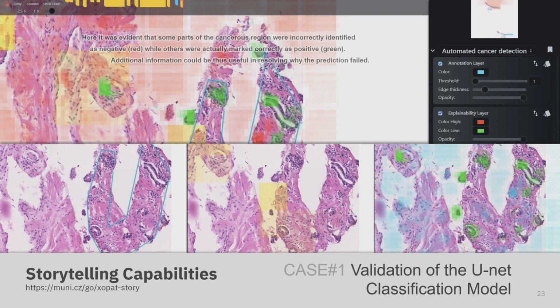Such visualization can help to spot misalignments, invalid model configurations, for example patterns in the data, and mainly inspect the data in a broad context instead of a few small patches. Here, for an unknown reason, a highly performant model failed prediction on a horseshoe-shaped tissue part. XAI methods can help in further understanding of the model outcomes.